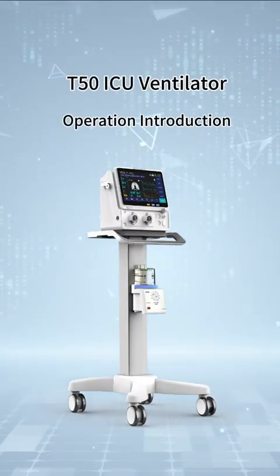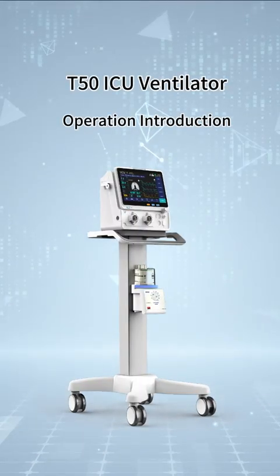T50 ICU ventilator. Operation introduction.